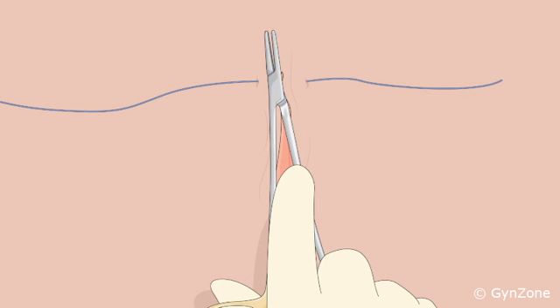This illustration will show how a square knot is tied step by step. The needle holder should be positioned between the two thread ends for each throw. Here you can see how the needle holder is positioned between the two thread ends at the beginning of the first throw.